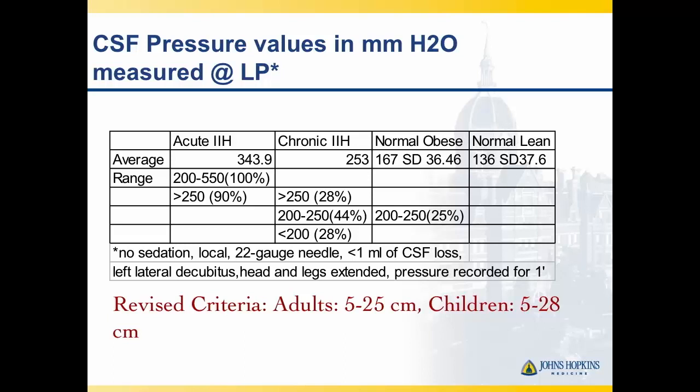We all know this chart. Dr. Friedman was instrumental in developing some of these guidelines. We know the criteria now, but these are, again, pressures in LP in the left lateral decubitus position.